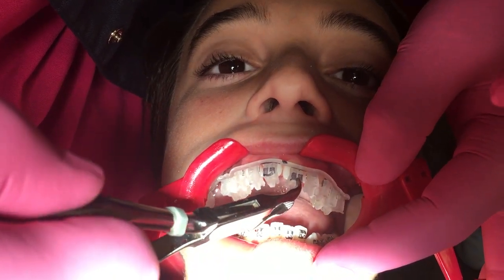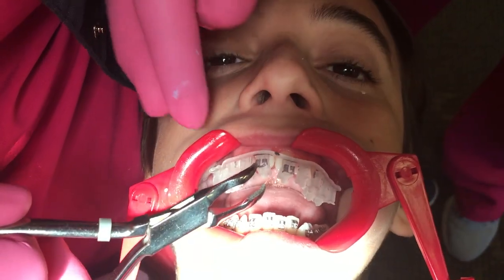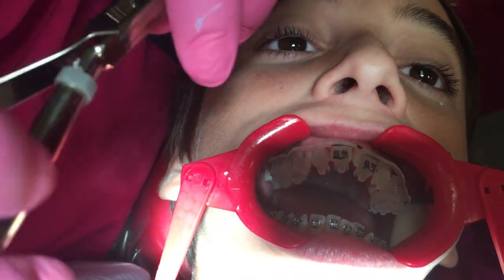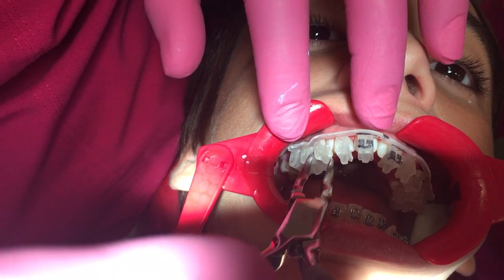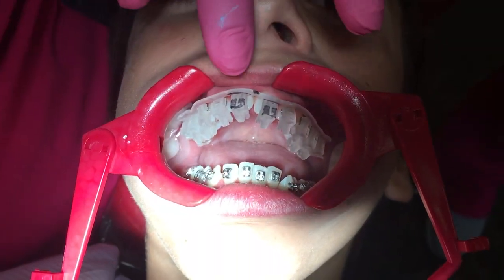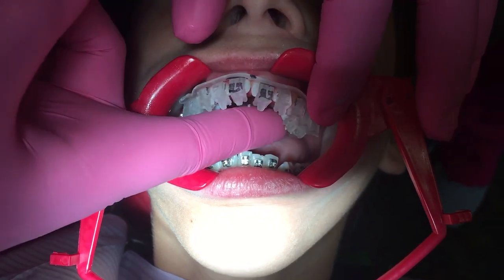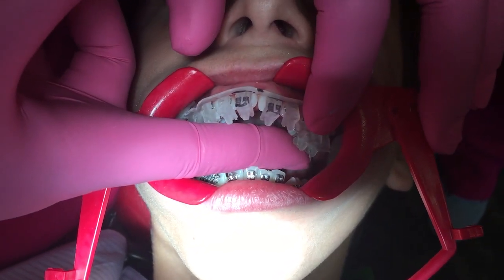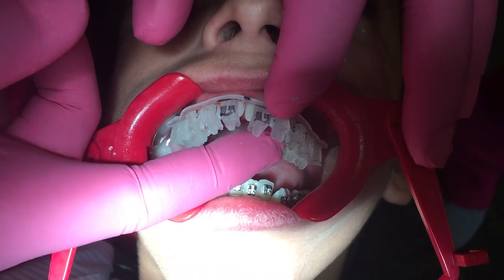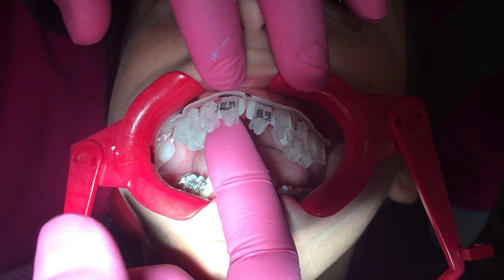That's it. Perfect. You don't need to just pull it all the way, because then you will bring the tray to vocally, and will bring the next bracket. You see, you hear that sound? That's the sound that you need to hear. That's it. Last one. Perfect. That's it. Now fingers in, tap it. Open just a little. From that box, tap it buccally. Gentle and slowly — this is the process of gentle and slowly. Keep on moving forward. Keep on moving. They will just release by their own. Keep on moving. Okay, now you see how it lifted? Keep on doing this until it lifts everything.